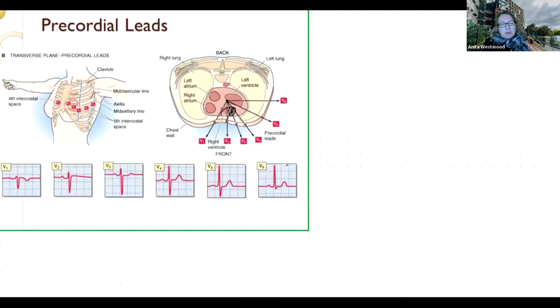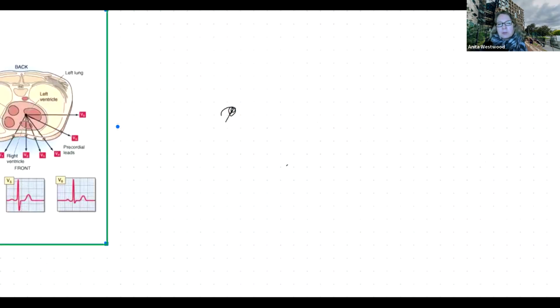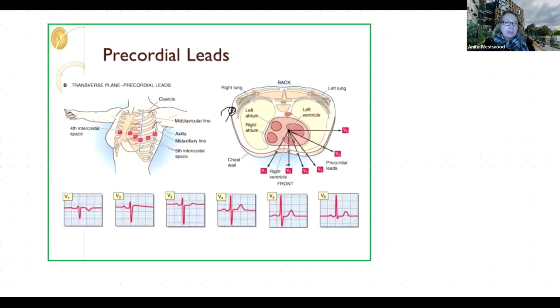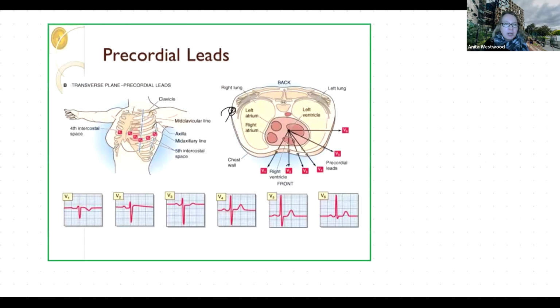The thing that gets confusing here is that we can use this 12 lead, use these limb leads, because we can use them to look at other aspects of the heart by looking backwards up through the voltage changes that we see. And we'll talk about reciprocal and facing leads and contiguous leads and all those sorts of things a little bit later. But there are ways we can do that.